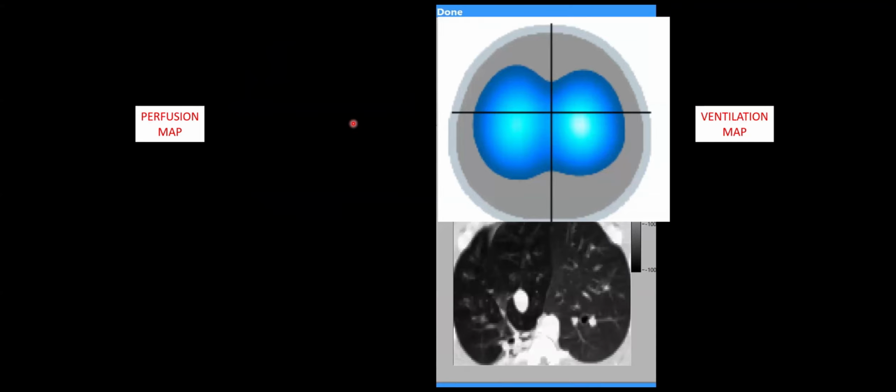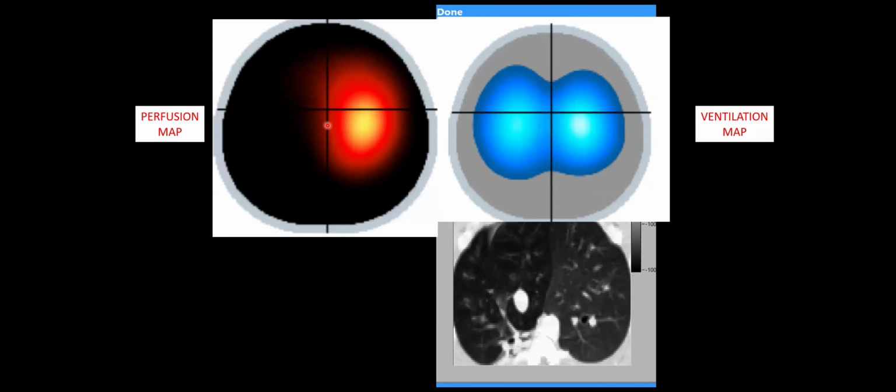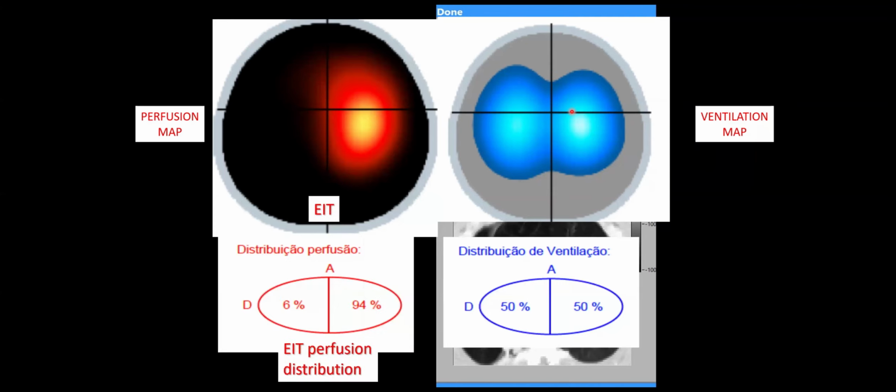Interesting, in this particular case, the ventilation was bilateral. And we can see that both lungs were aerated because the pathology here was just a model of pulmonary emboli caused by the Swan-Ganz catheter. So we had unilateral perfusion, bilateral ventilation, as shown here.